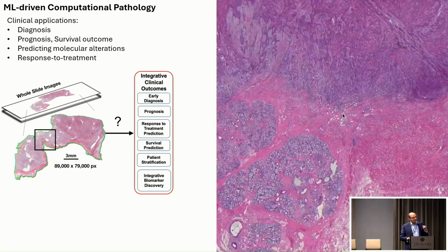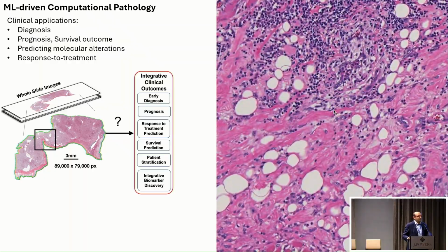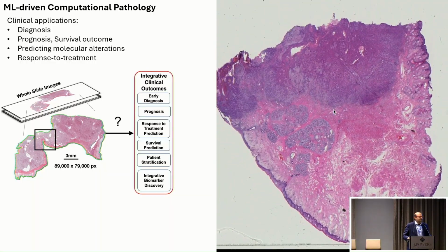So we predominantly work on pathology images. It's often regarded as the last modality in cancer research to be digitized. It's a 150-year-old modality. It's been around for a really, really long time, but the computational analysis of these images is relatively very recent. So we see all these other modalities like genomics and proteomics and so forth that came about much later and they were inherently digital.